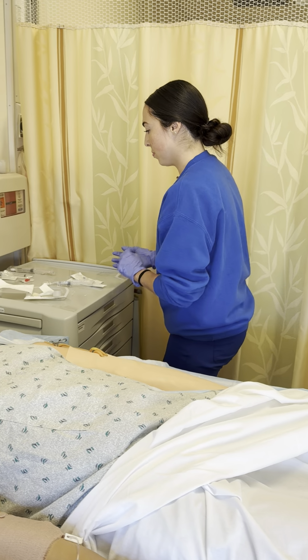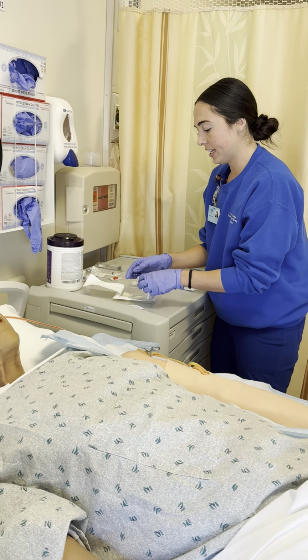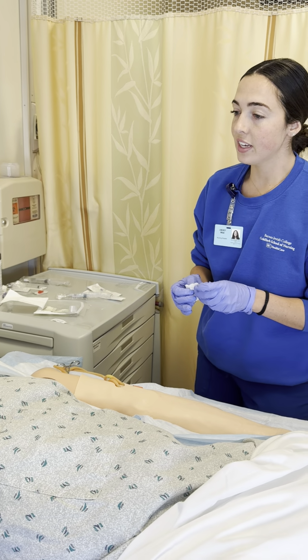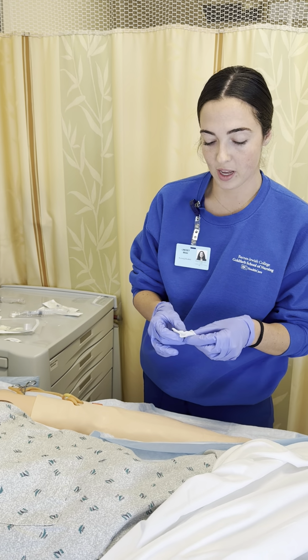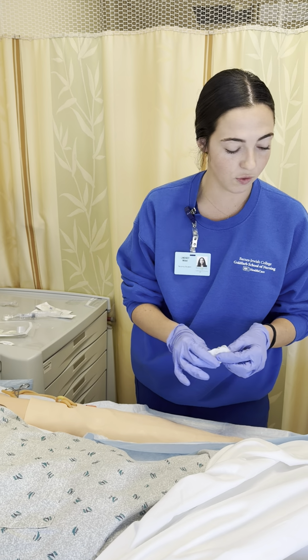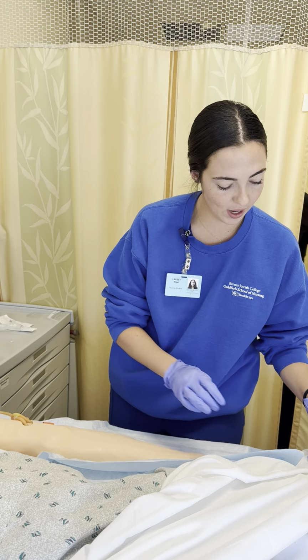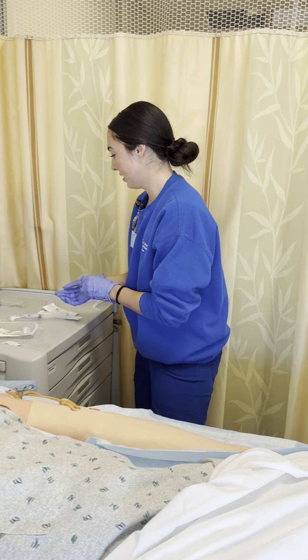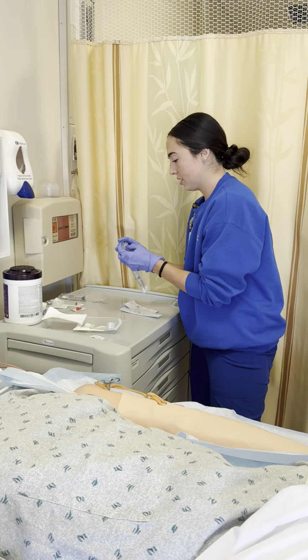I'm going to dispose of that, and now I'm going to get the rest of my supplies ready. So, in our kit here, I have a piece of gauze. Ivy, is it okay if I place a few items on your bedside here? Okay, I'm going to ask that you stay still for me, so that we don't lose any of these items. I'm just going to place my gauze to the side. I'm going to open up my sterile flush.